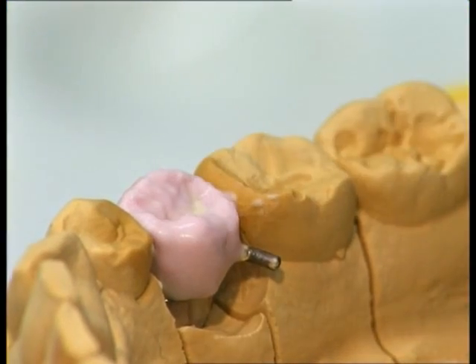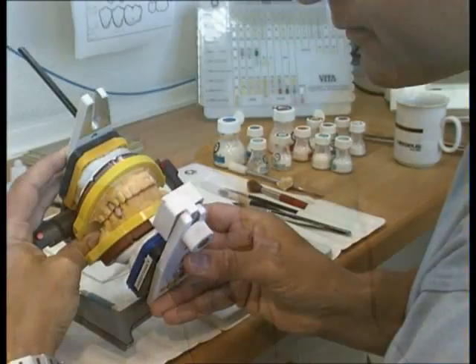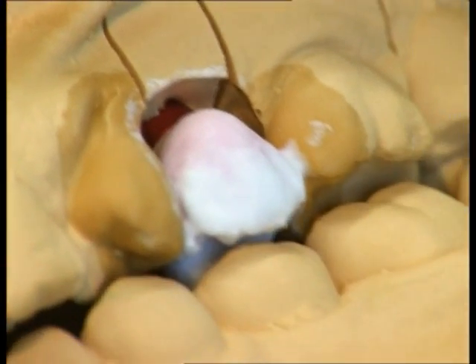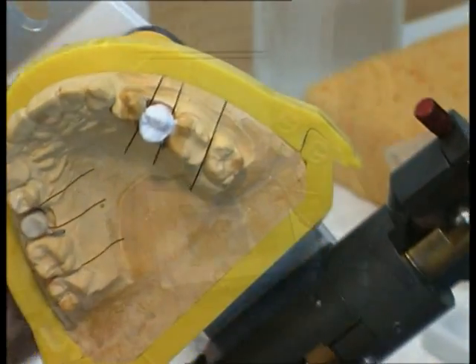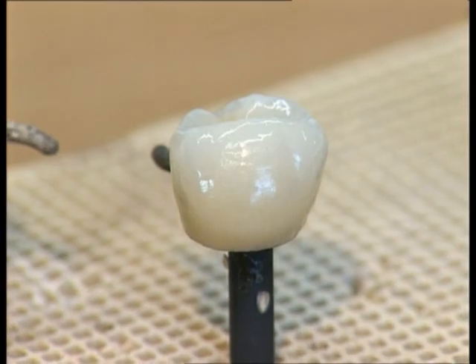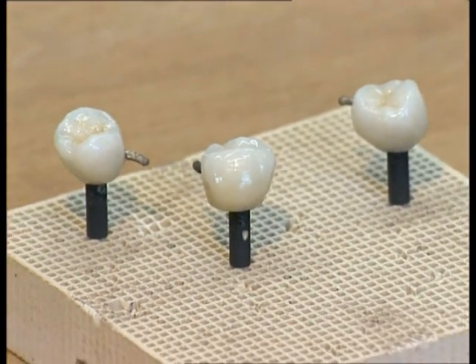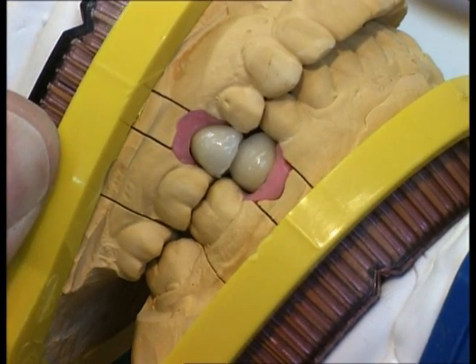After core firing, the casting is veneered following anatomical guidelines. This is followed by main firing, correction firing, and glaze firing. These are the finished porcelain fused to metal crowns. They can be seated on the analogues without the slightest tension.